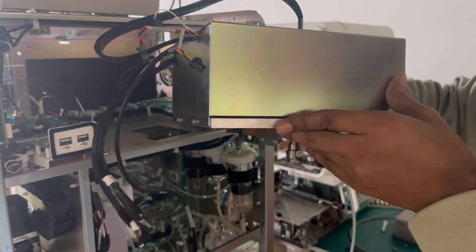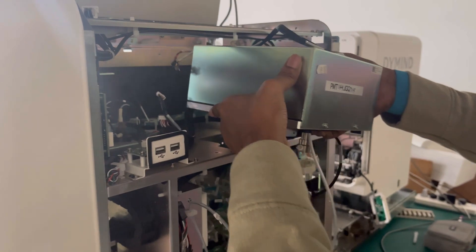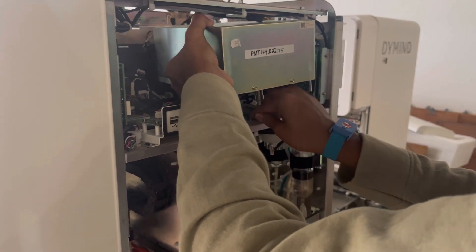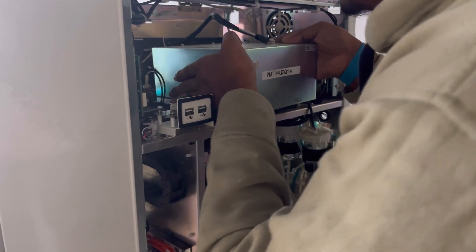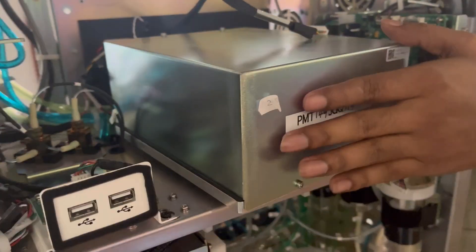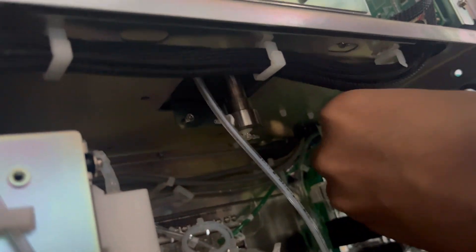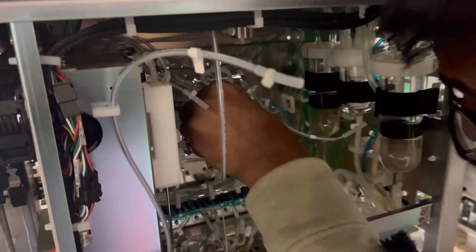Now we will assemble the optical unit again. At first, take the tube, insert it inside, and keep it in position — remember there is one tube here. Fix the screws. There are two tubes total and four screws. This is valve 39 and port 1 — connect to valve 39, port 1. Here is the valve 39 label, so according to the label you can connect.